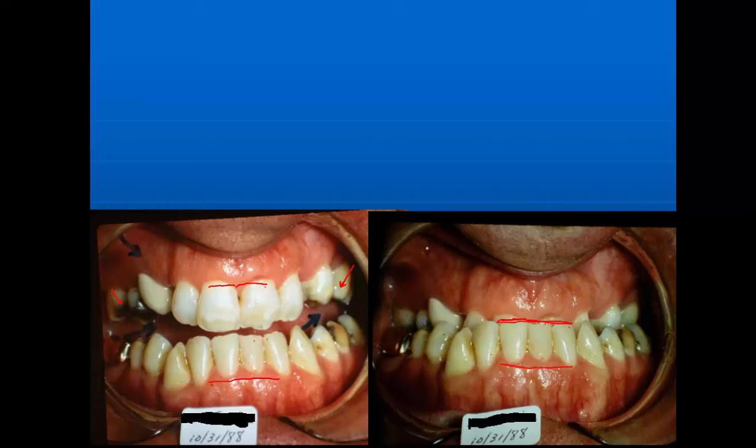So when I open this up and have about a millimeter clearance here between the teeth, you've got a gap back in here. It's probably slightly wider than this out here in the front. Or it may not be any wider, but it's quite a distance between the teeth back here.